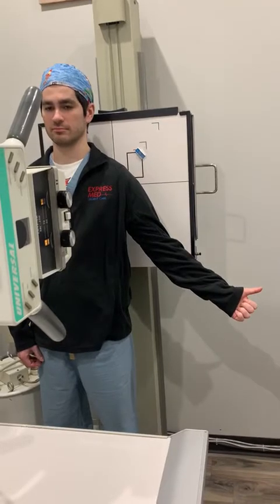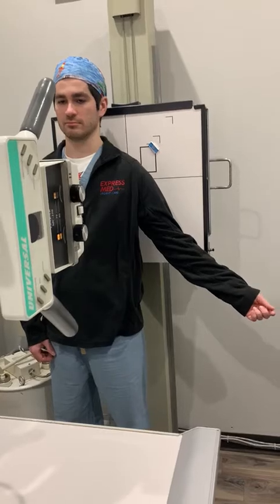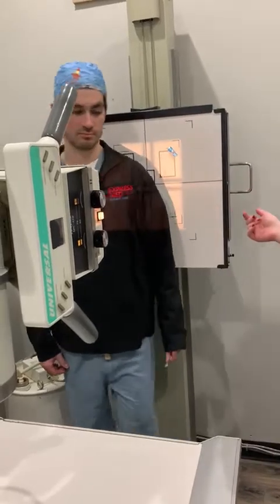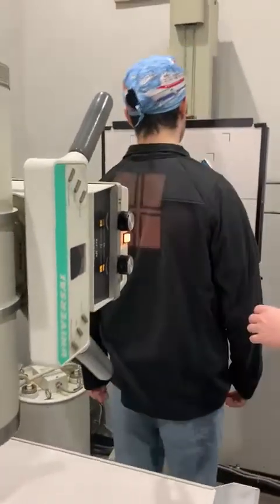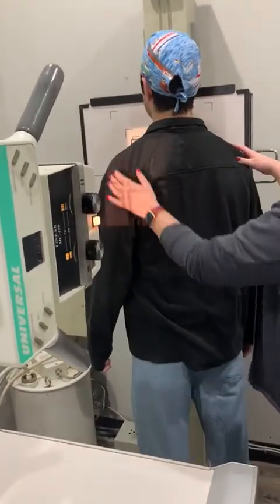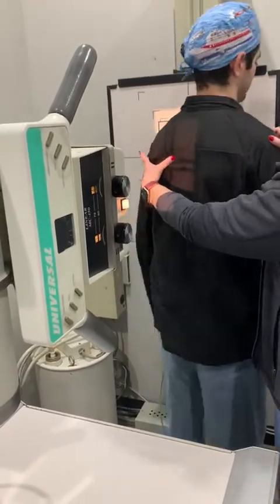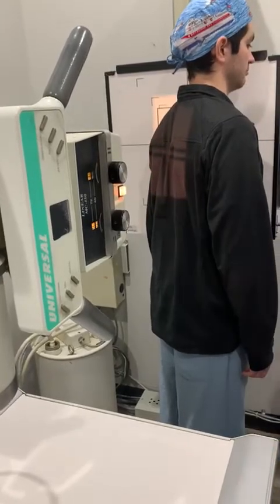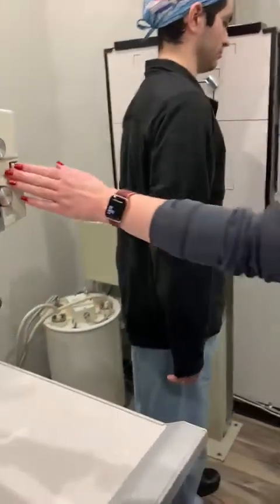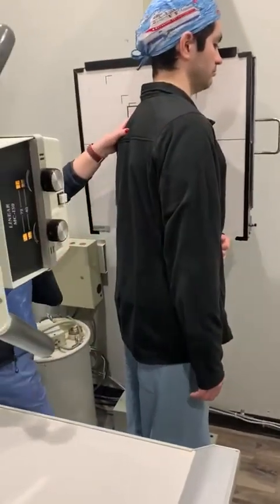Now the tricky part — we need to do a Y-view as the third view. I want you to face the board for this part. Since we're doing the left shoulder, your left shoulder will touch the board. For the Y-view, go ahead and put your hand on your belly again with the other arm.